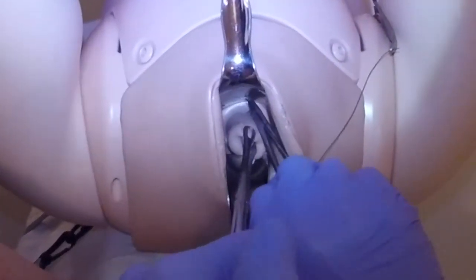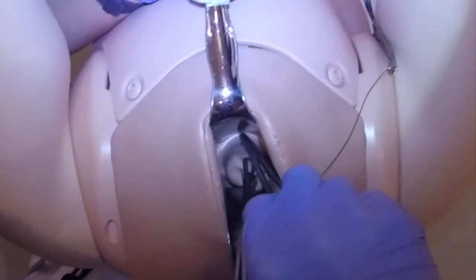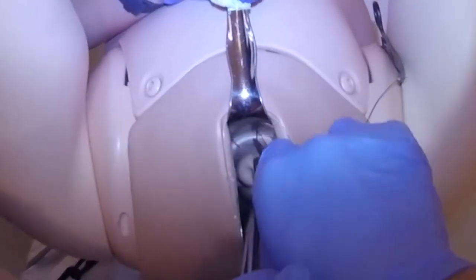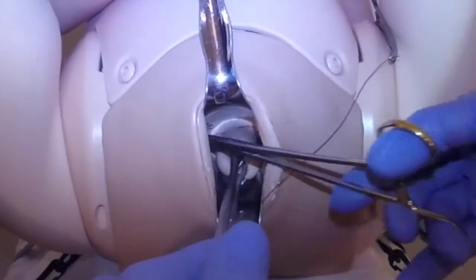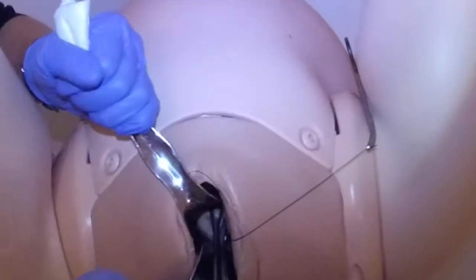I'm going to go deep enough so I get some cervical stroma — I can feel that — but no more deep than I have to. I want my suture to circumscribe as much cervix as possible. Daisy, if we now go to eleven o'clock and seven o'clock.